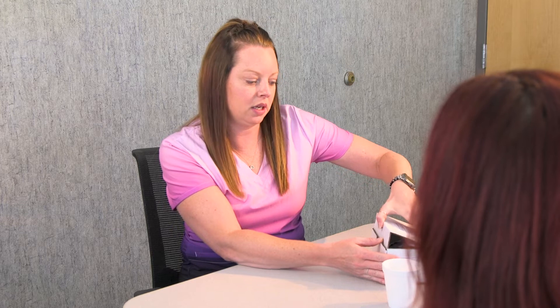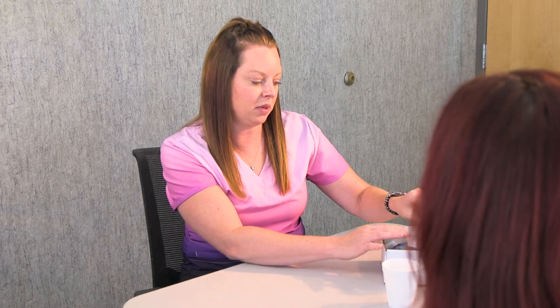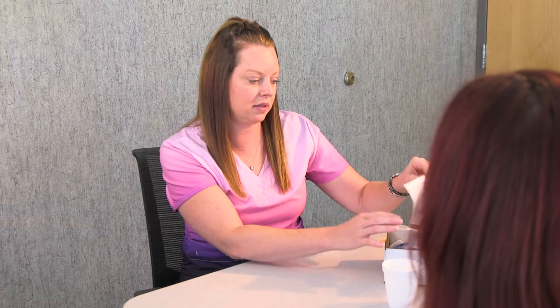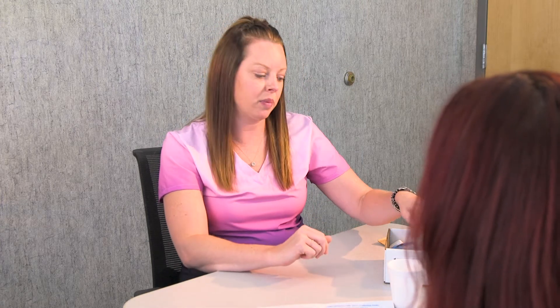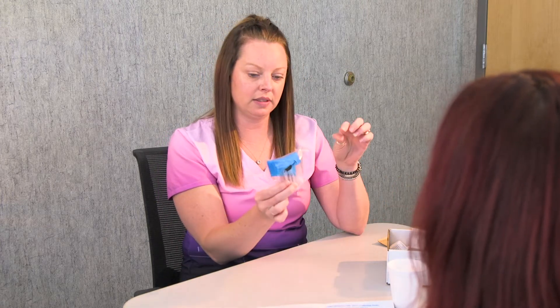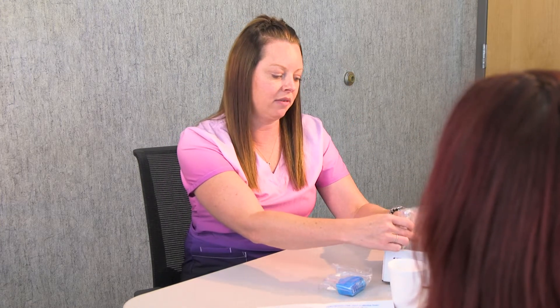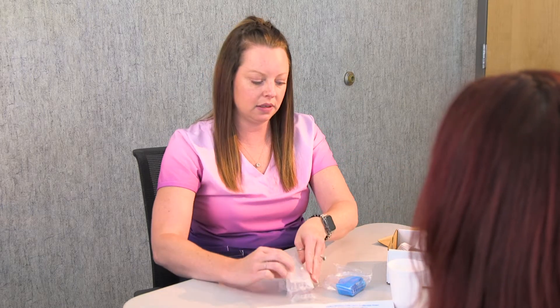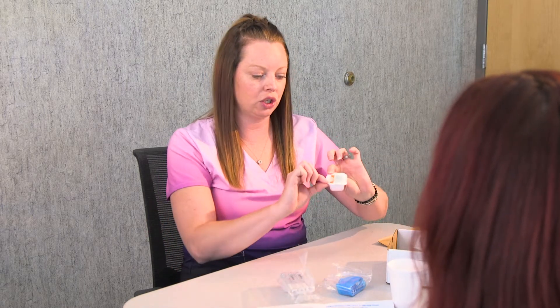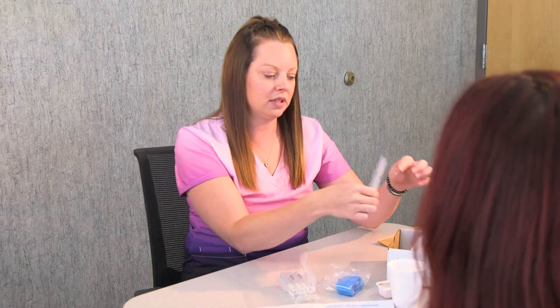First, you'll start by opening up this box. You'll have some instructions here in the box to go over. You will also have your device that you blow into, and some tubes that you will blow into — you'll have six of them in this test. And then you have this sugar packet that you will be mixing, and you'll have some labels.